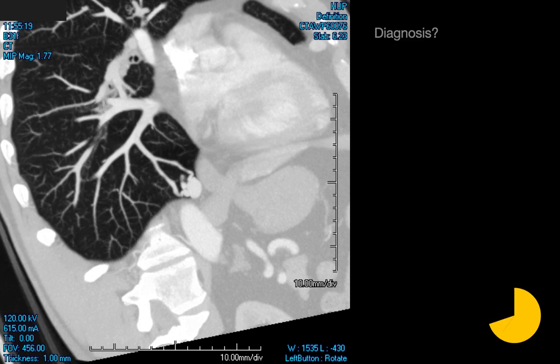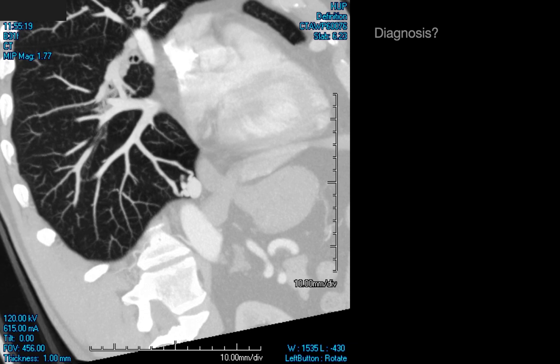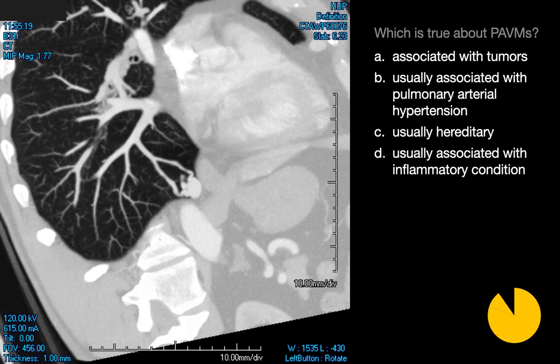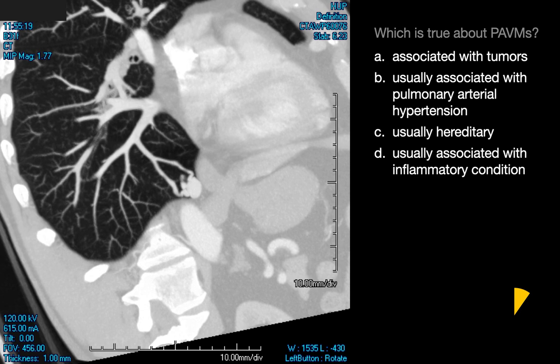We have a relatively well-circumscribed nodular opacity that's avidly enhancing, the same as the adjacent vessel, and it's associated with two rather large blood vessels. Comparing the diameter of these peripheral blood vessels to other vessels at the same peripheral level in the lung, this is a pulmonary arteriovenous malformation. Pulmonary AVMs are not associated with tumors, not usually associated with pulmonary arterial hypertension, and not usually associated with inflammatory conditions. The true statement is that they are usually hereditary.